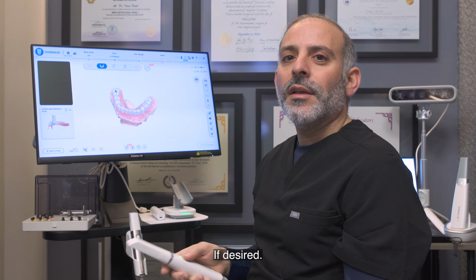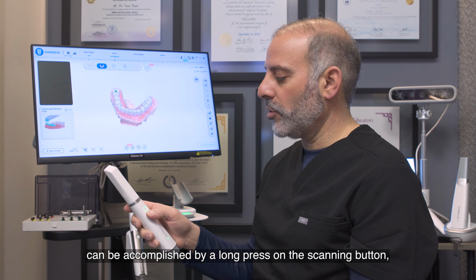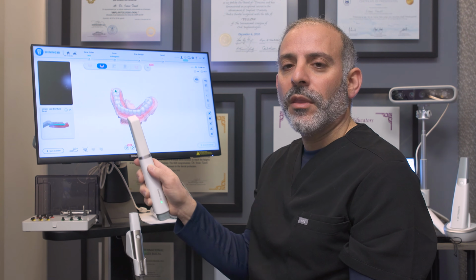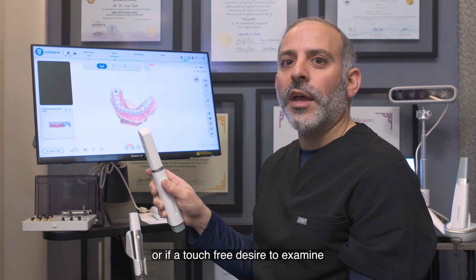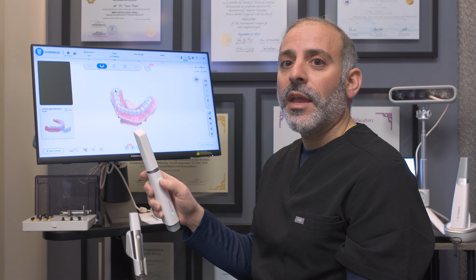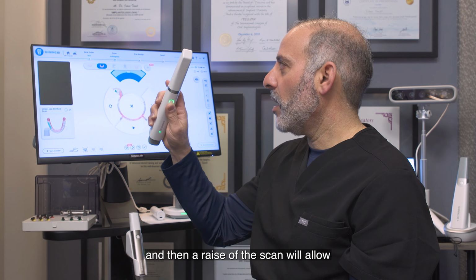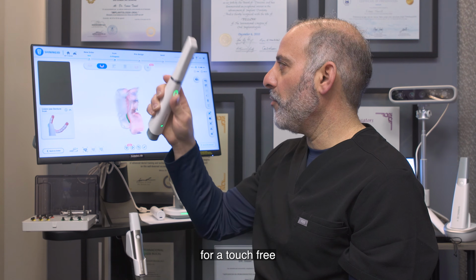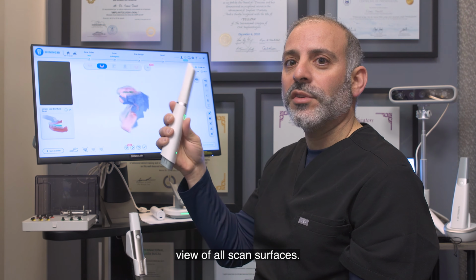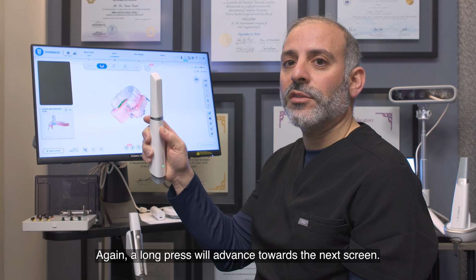If desired, a touch-free method for advancing to the next screen can be accomplished by a long press on the scanning button, or if a touch-free desire to examine the actual scan is desired, a double tap of that home button and then a raise of the scan will allow for a touch-free view of all scanned surfaces. Again, a long press will advance towards the next screen.